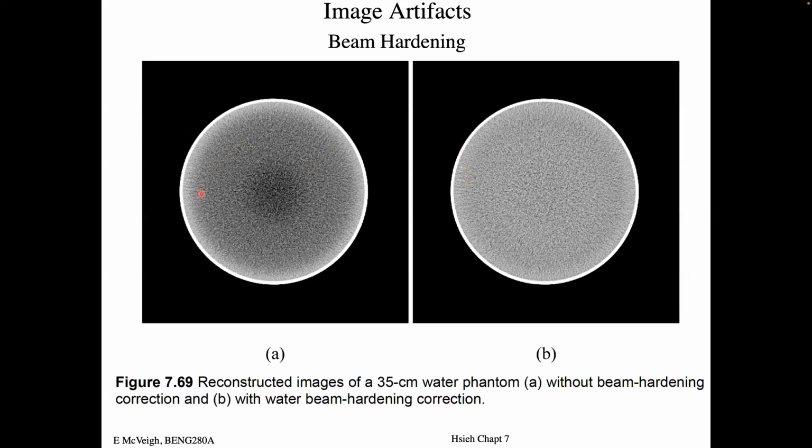Well, the reason it's symmetric here is because the object itself is completely symmetric, right? For this process, depending radially on where I am, I will have experienced exactly the same beam hardening effect as all of my pixels that are on the same circular path here, right?